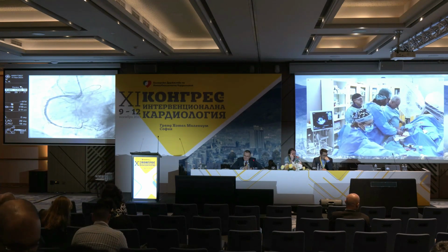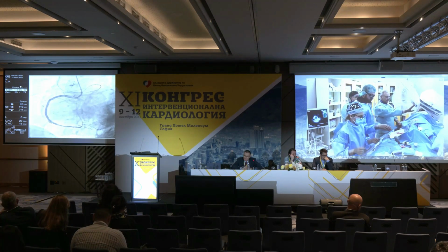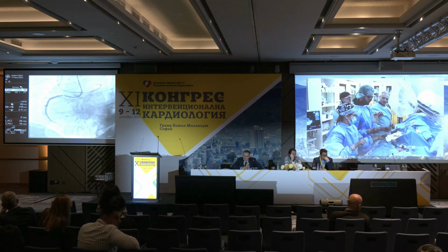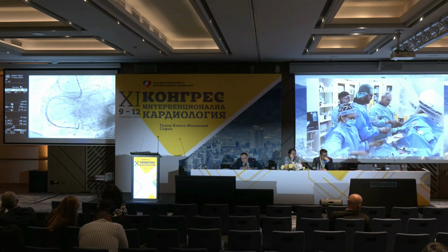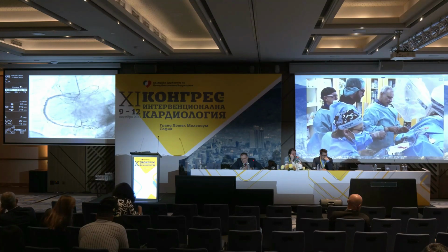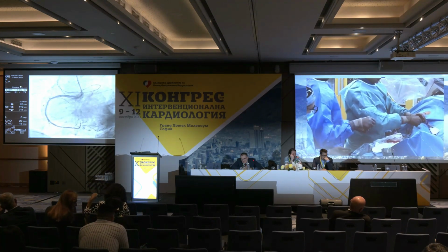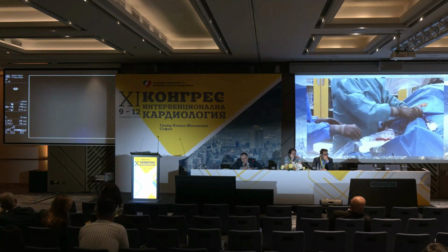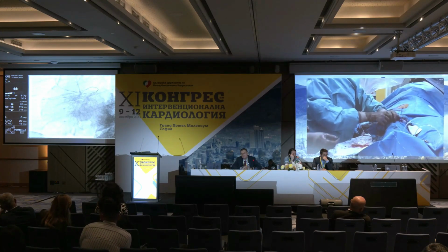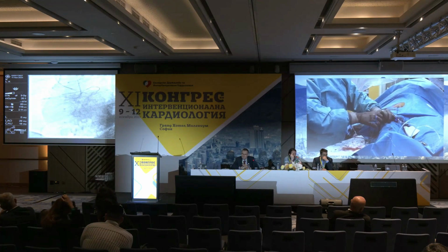Let's move on. I will remove the retrograde things. The antegrade guiding catheter is sitting perfectly there. There is no problem of accessing antegradely. Let's remove the retrograde and show how we would do that. Then we will reevaluate again, because removing the retrograde gear is still a process. I will reinsert the wire that I had before to avoid any left main deep engagement and potential dissections. Okay, you see it there.